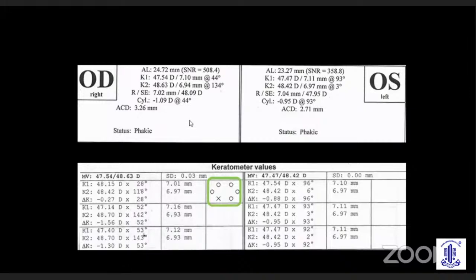So at the beginning, in case if this patient is going for a toric IOL, at the beginning of your calculation, you are already offset by 10 degrees. The results are not going to be convincing. So in a manual mode, as you can see here, there is a traffic light signal. The green says it is perfectly on focus. Yellow says it has to be focused a little bit, and if it is red, it's completely out of focus.